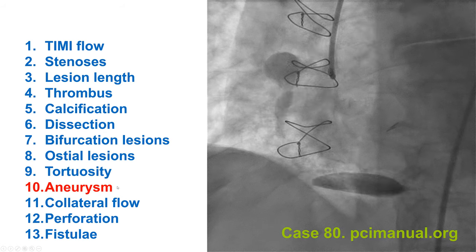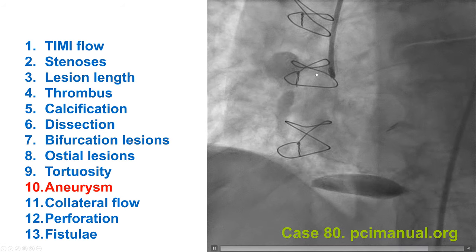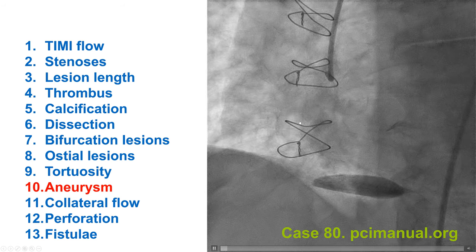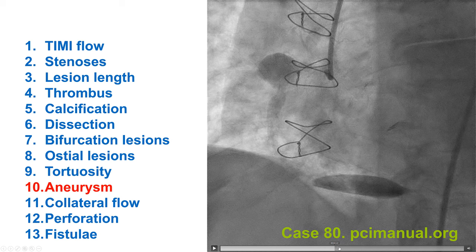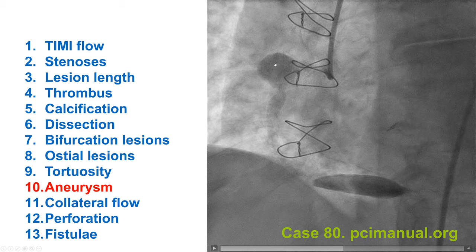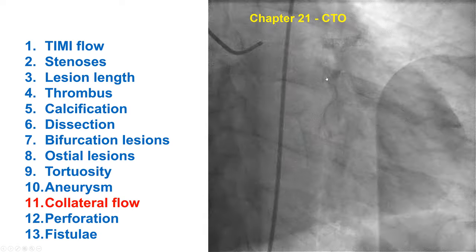Characteristic 10 is aneurysm. Aneurysms are defined as coronary artery diameter more than 1.5 times the reference diameter. Here we have a clear aneurysm in the proximal right coronary artery. Case 80 in the PCI manual provides an example of such a case treated with implantation of a covered stent.